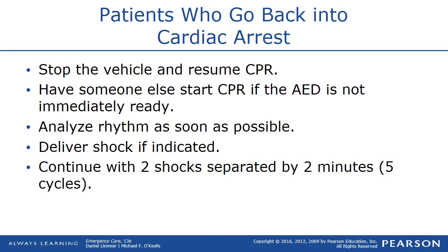If the patient goes back into cardiac arrest, stop the vehicle and resume CPR. Have someone else start CPR if the AED is not immediately ready again. And then as soon as you get it ready, analyze the rhythm and deliver a shock. Continue with 2 shocks separated by 2 minutes or 5 cycles of CPR.